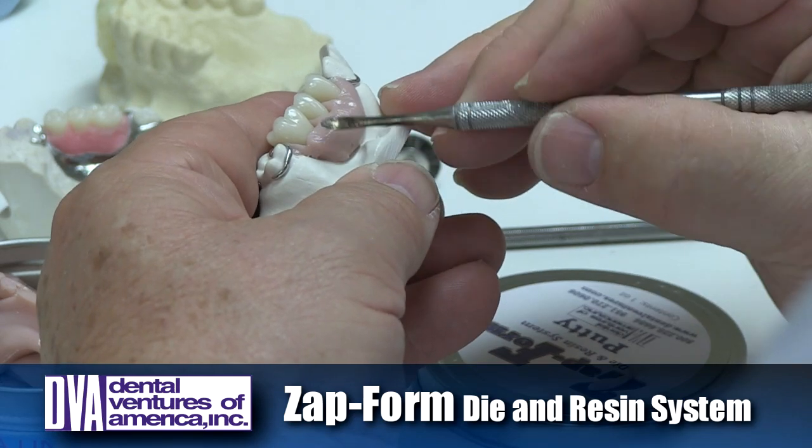Now we're basically ready to put separator on and cure the appliance. But there's another use for the putty — you'll find all kinds of uses for this material. We can block out the undercuts: simply take a little piece of the putty, put it into the undercut area, and then sculpt it. You can do all kinds of stuff — like if you're doing an all-on-four case and you're picking up temporary cylinders, you can make a dam and hold the acrylic in place. If you're duplicating a model and you have a bar underneath, you can use the putty to block out the undercuts.